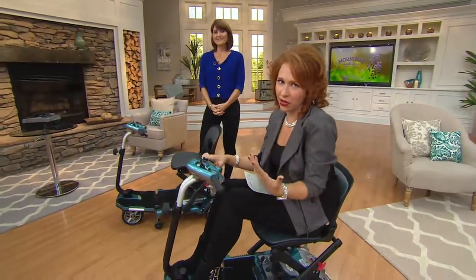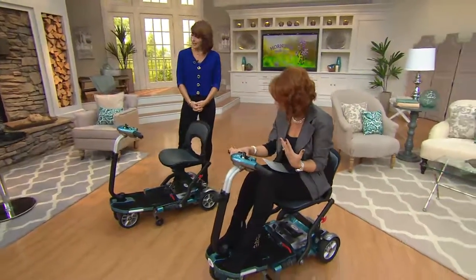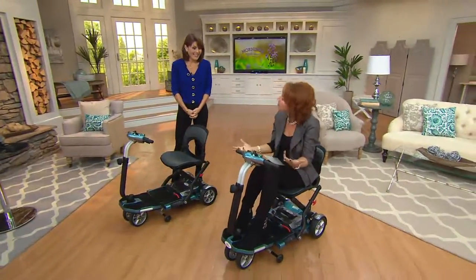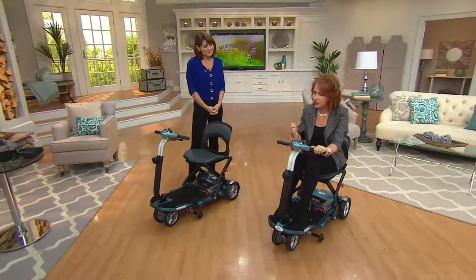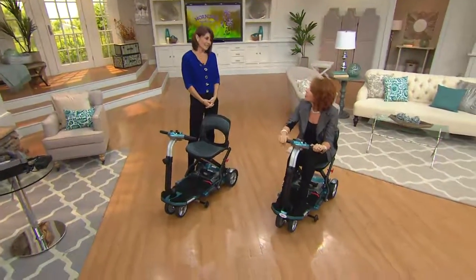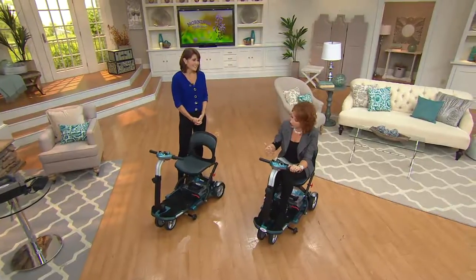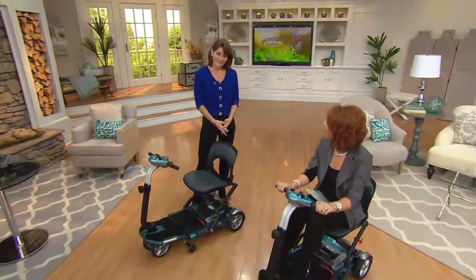Mobility is a big issue. This country is enormous and there's a lot of stuff to see and do, but a lot of people don't feel like they have the type of mobility where they just end up staying home because they don't want to slow us down. With about 30 years of experience in the home health industry, this is called the EV Rider and it really helps to improve our quality of life.